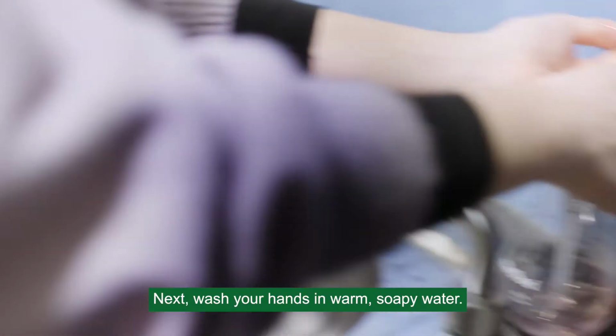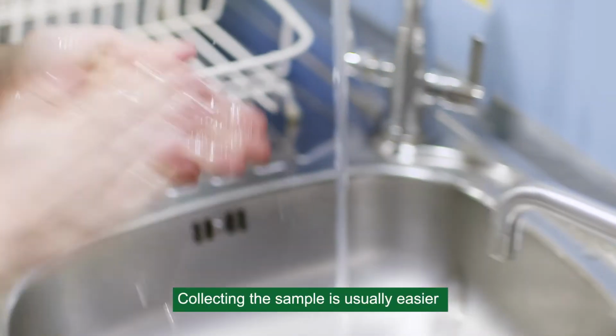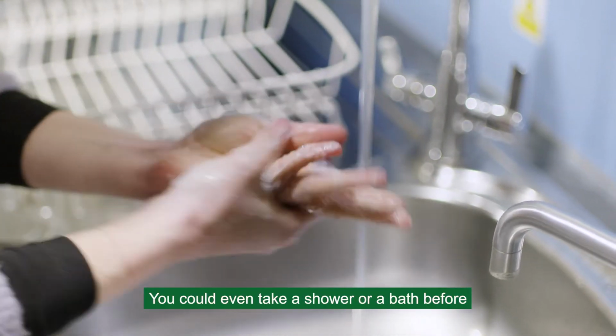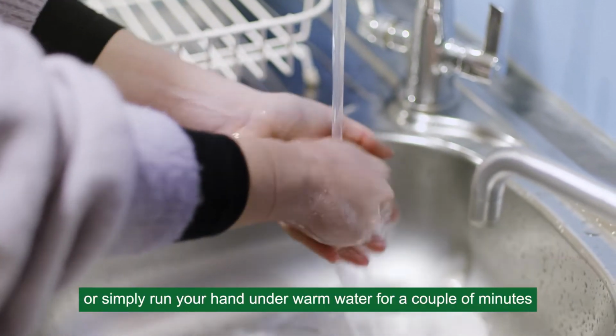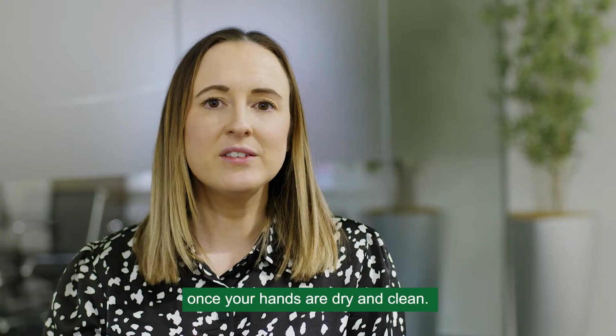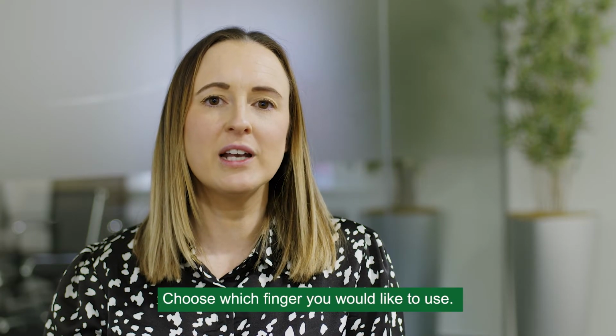Next, wash your hands in warm soapy water. Collecting the sample is usually easier when your hands are warm. You could even take a shower or a bath before, or simply run your hand under warm water for a couple of minutes. Once your hands are dry and clean, choose which finger you would like to use.